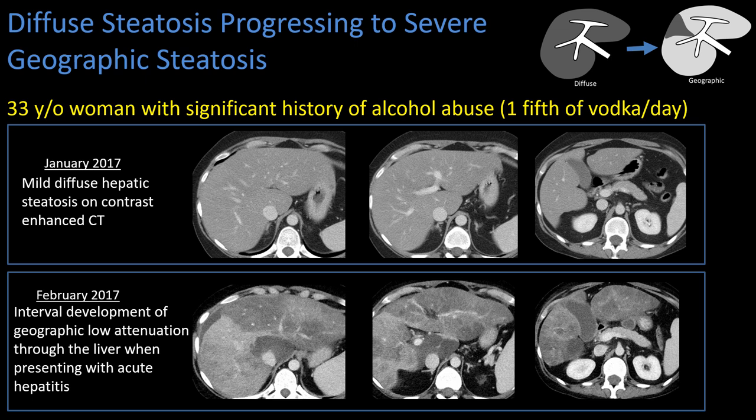Here we have a 33-year-old woman with a history of alcohol abuse who had mild steatosis. We can see some mild steatosis — decreased density of the liver relative to the spleen — and that mild steatosis worsens quite dramatically.